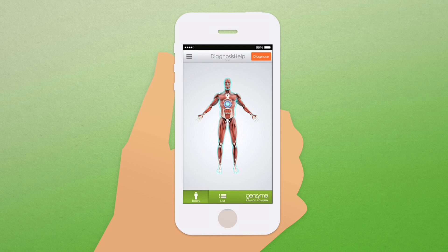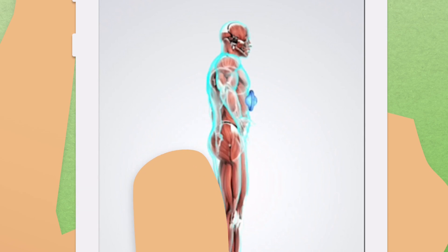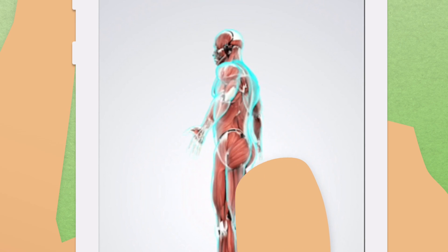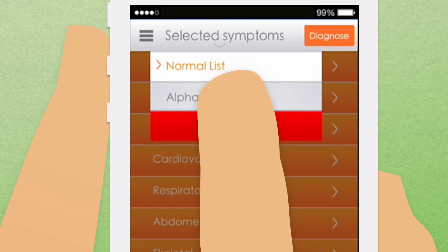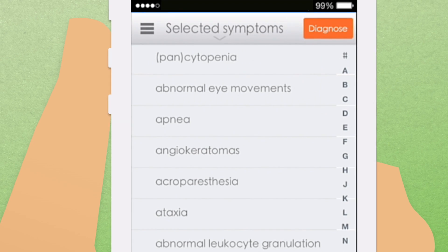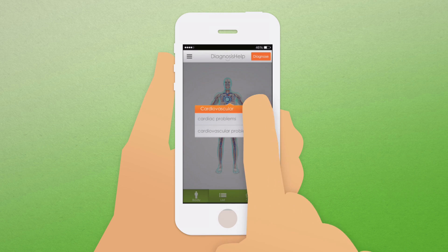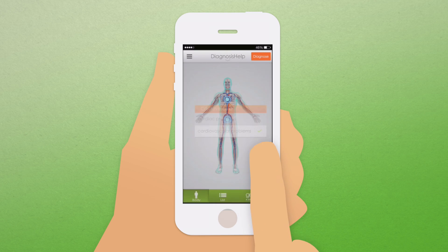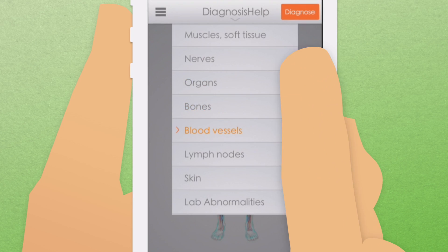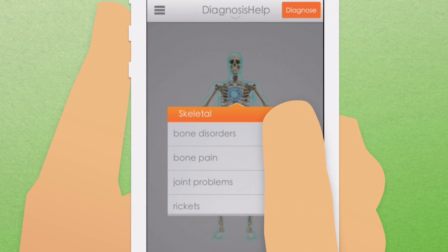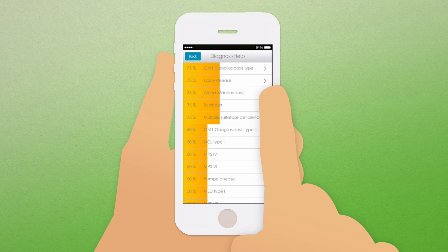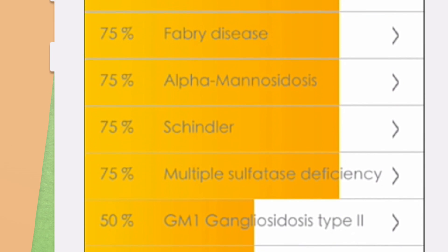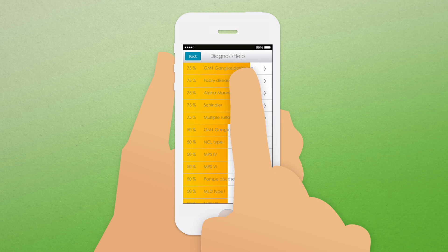The application offers three ways of navigating through the list of symptoms: body view, category view, and alphabetical order. Once you have completed the selection of symptoms that are applicable to your patient, you hit the diagnose button and a list of possible lysosomal storage disorders is displayed. The list is categorized by the highest possibility on top.